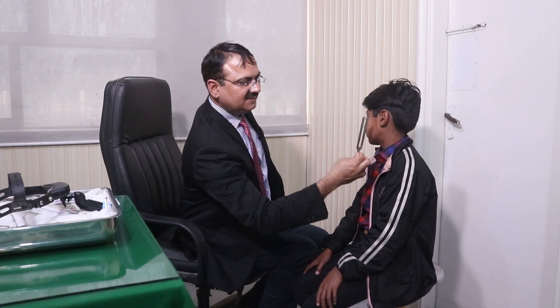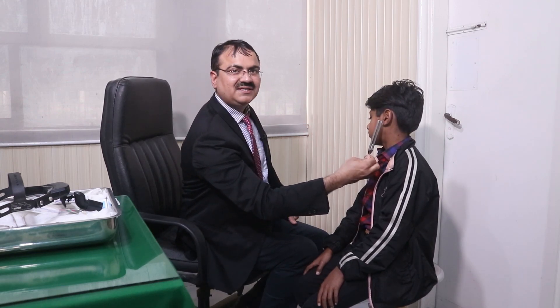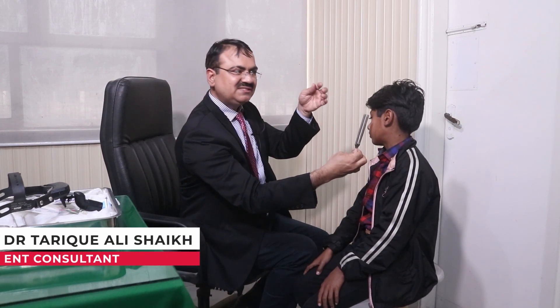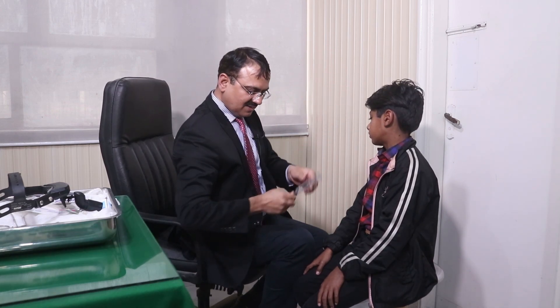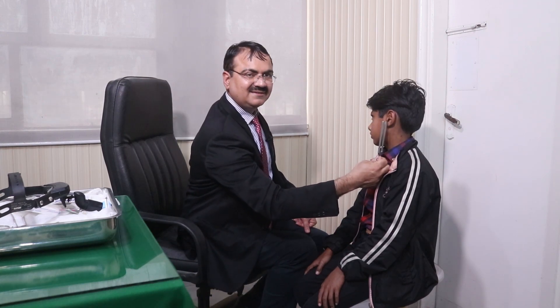You have to hold the stem at the neck area — the bone — directed along the external auditory canal. This is the vibration pathway: the canal, the tympanic membrane, the ossicles, and ultimately the sound travels towards the brain. The sound should always be at the level of the external auditory canal. In this patient, you have said that you can hear the sound better — this is the Rinne positive.